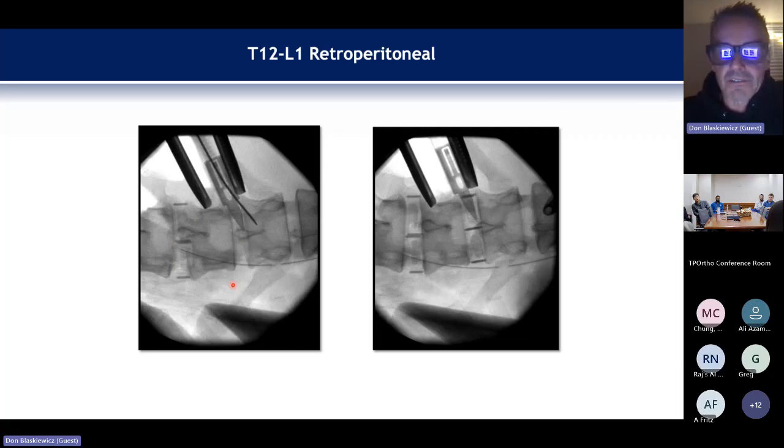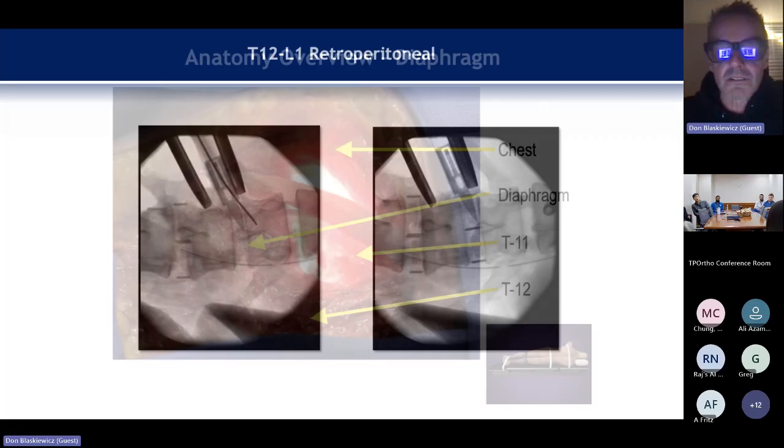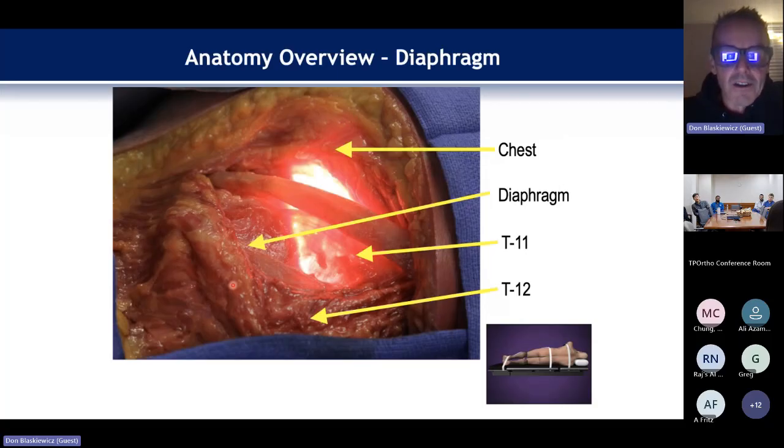This was just a stock image for doing a lateral. And this is kind of interesting. This is transillumination of the chest wall, and you're looking at the overlying ribs. So this is probably 10. And this is where the 12 body lies and the 11 body lies. So you can see this whole thing here where I'm kind of circumscribing with a laser pointer.